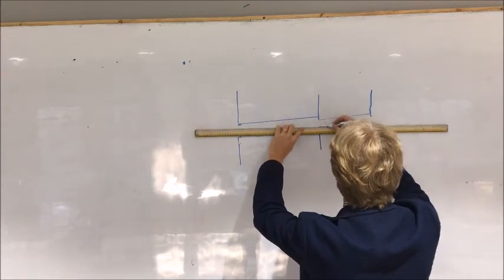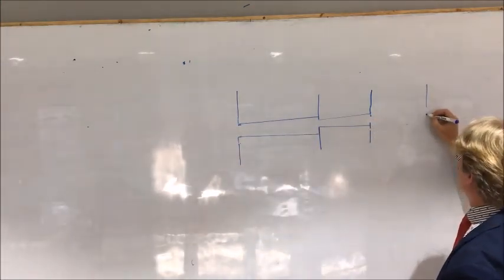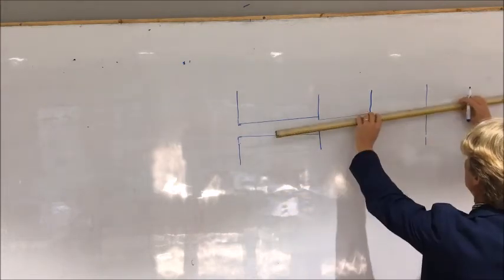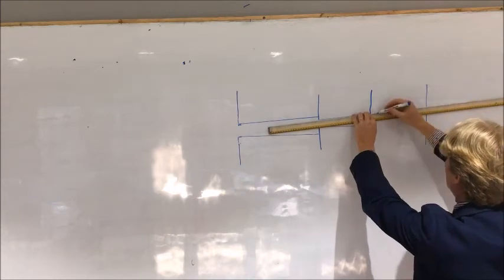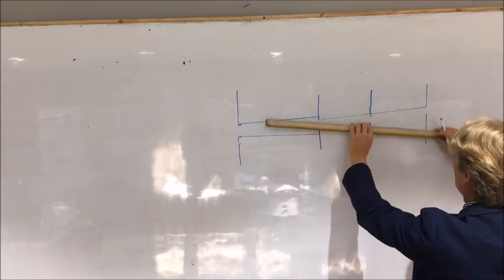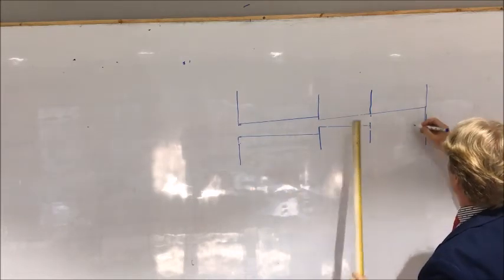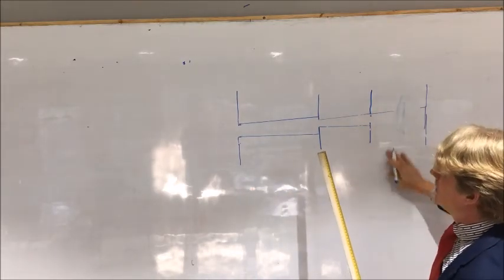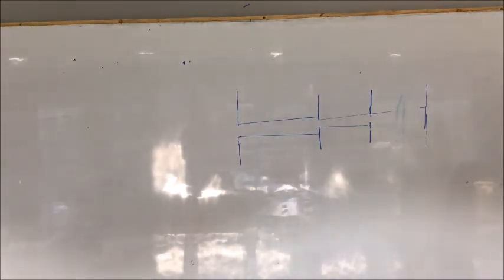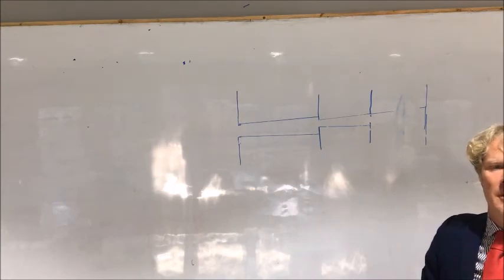And then again, that allows me to have a big distance between what I'm X-raying and the object, and I get a small penumbra, even more so. So this is my receptor. Now when I have my board rubber, it will be less. So that's collimating the beam. That's done with lead shielding, and that will also improve the sharpness of the image.